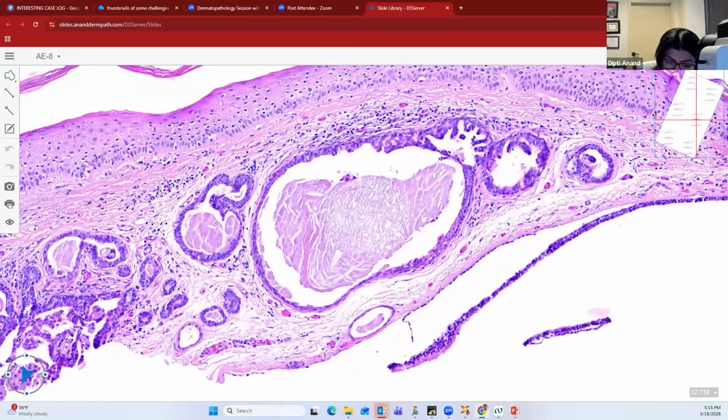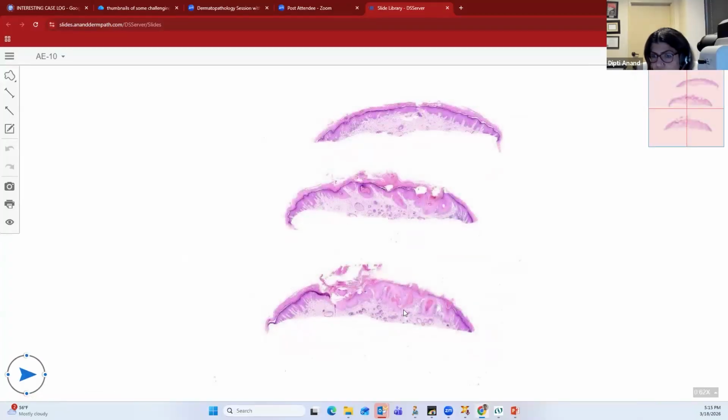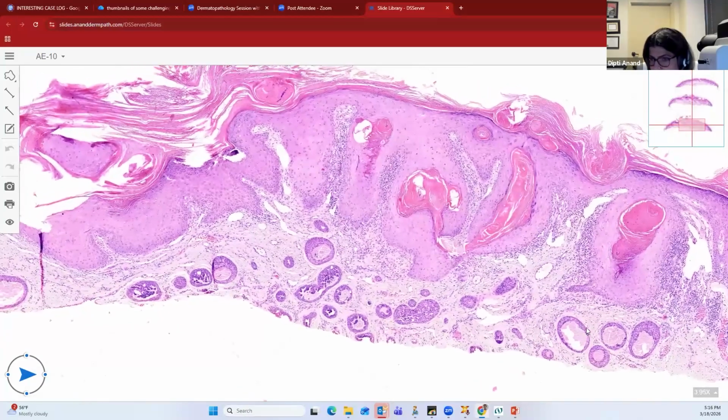One step beyond it is the tumor referred to as tubular apocrine adenoma. Tubular apocrine adenoma occurs most commonly on the scalp. Tubular apocrine adenoma and papillary eccrine adenoma are pretty much similar-looking tumors. So when you see these ducts in the dermis, as you can see over here, the three things that come to mind are tubular apocrine adenoma, papillary eccrine adenoma, and dermal duct tumor.